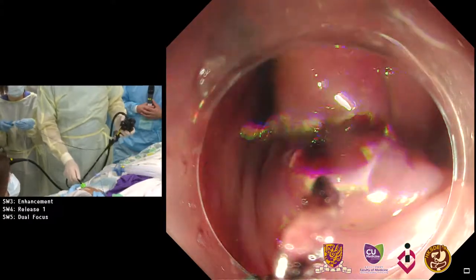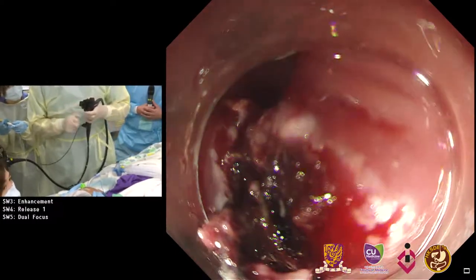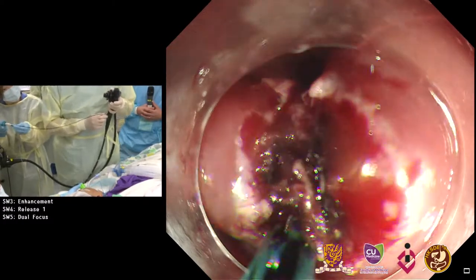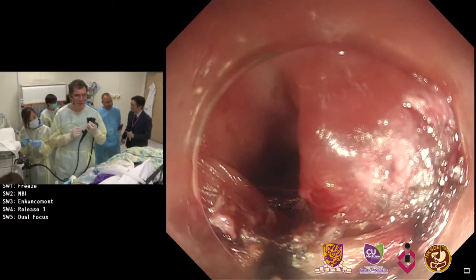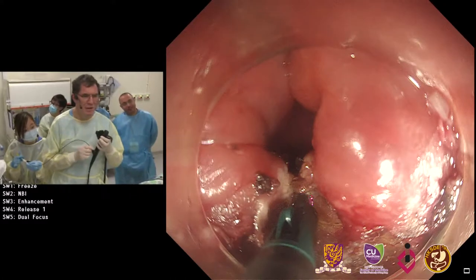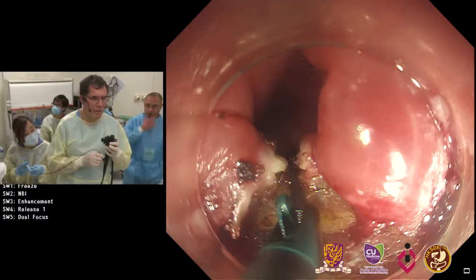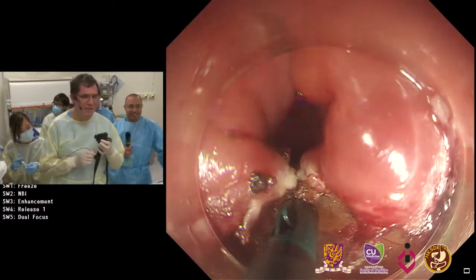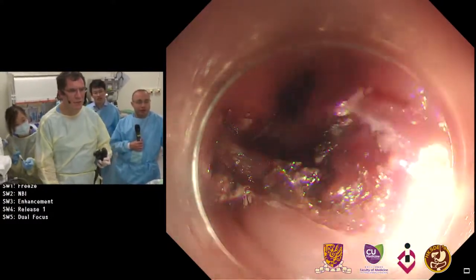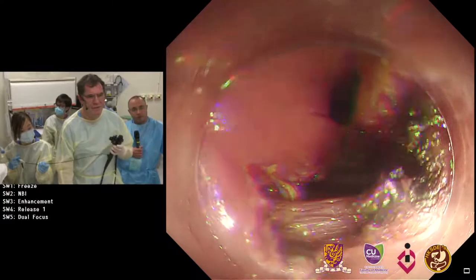Do you feel a little more stable now? It looks like you're down to the muscle — so you're cutting further down. It looks like you're doing a standard diverticulotomy. Yes, standard technique — no double septotomy on this one. It's because we don't have the special overtube and visibility is not good, so I'll use the SB knife just for a standard procedure. You can also use a hook knife. It's a small SB knife unfortunately, but it works quite well.